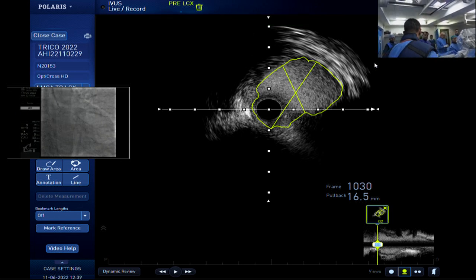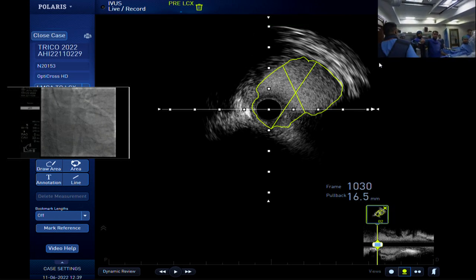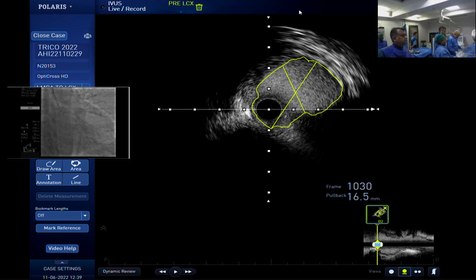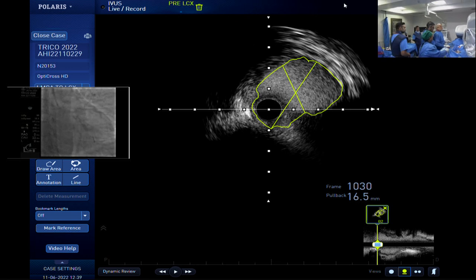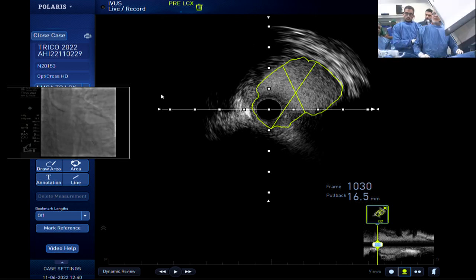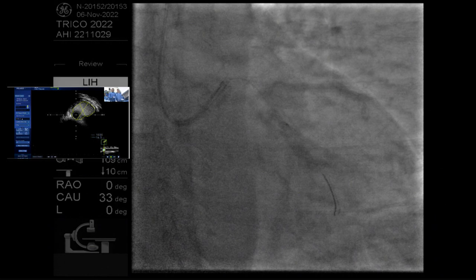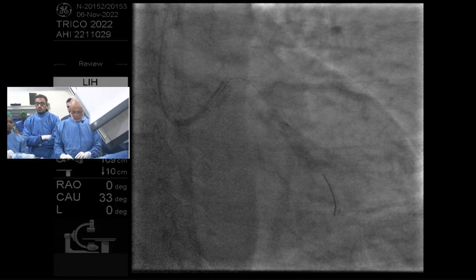Okay. And we can turn our attention to the circumflex now. So at this point, you don't need to wire down the LAD. You can take the IVUS out, re-engage your guide catheter, and you've got to wire down the main circ, right? So I would at this point, just so you can create a wire skeleton, create yourself markers, put a wire down OM1 because you don't want your stent going anywhere past that.